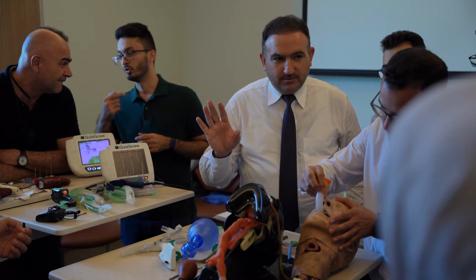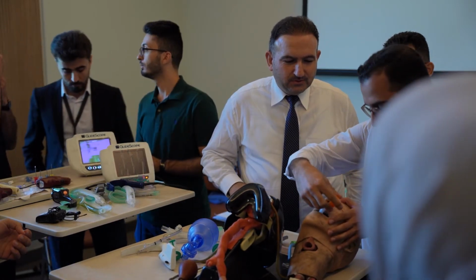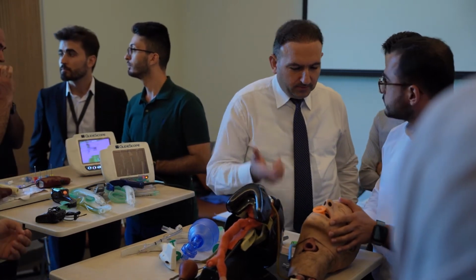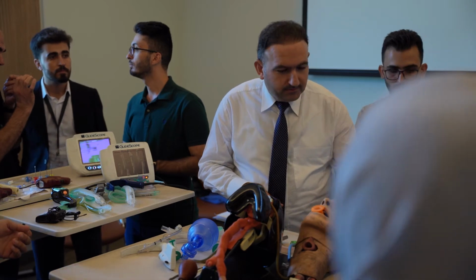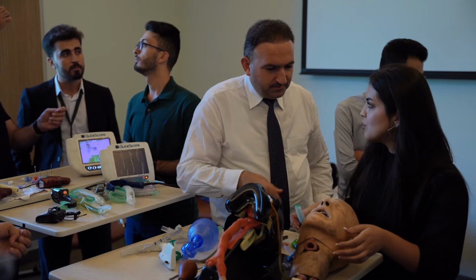How deep should we suction? Like this. You can start from the lateral side of the mouth, gently, smoothly, with a rotational motion, until you reach the base. Slightly encroach to the base of the tongue to see if there is a gag reflex. If there is a gag reflex, you should stop.